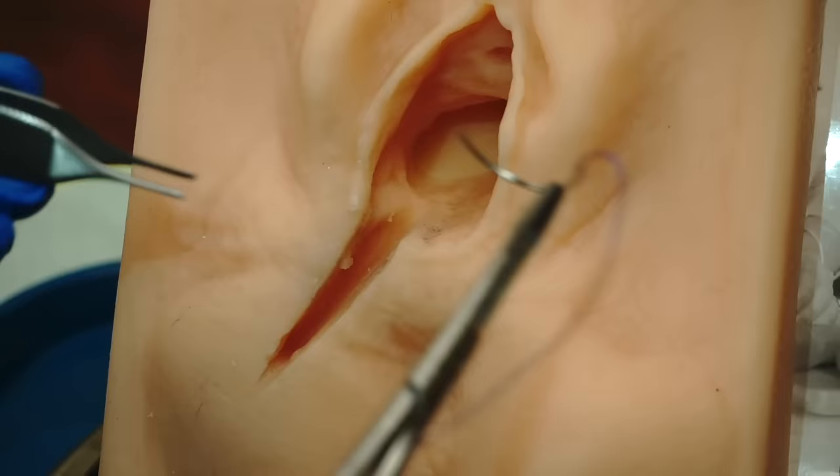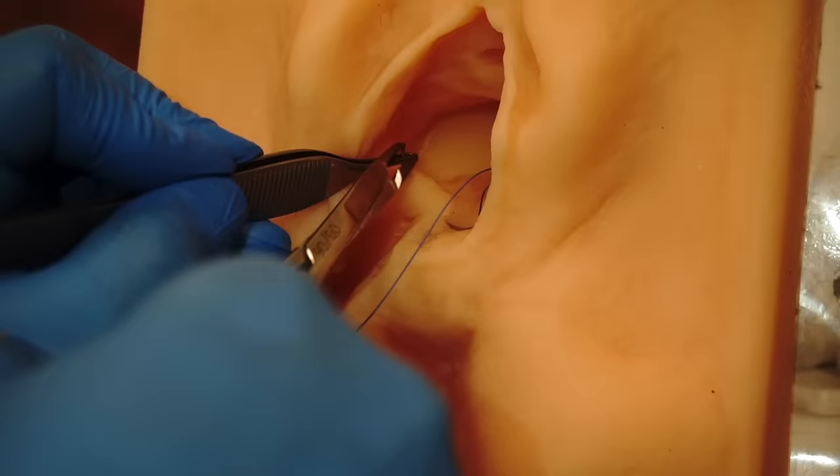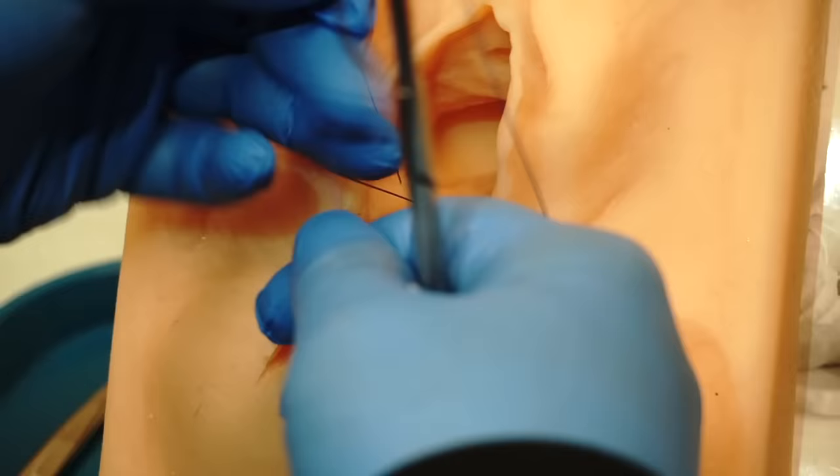I'm going to use 2-0 Vicryl as my suture preference to do this repair and I'm getting ready to start the apical portion of the repair — the horizontal portion — with my apical stitch. As you can see, I'm going high above the actual point of the laceration so that I make sure I get all of the arterioles that may have retracted in a cephalad direction in order to prevent a vaginal hematoma.